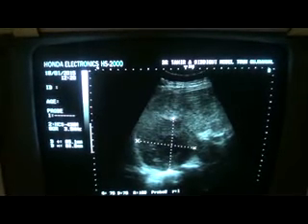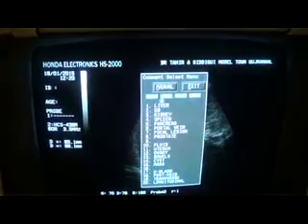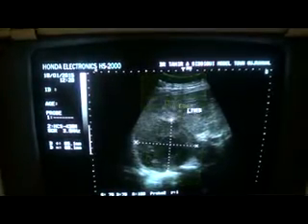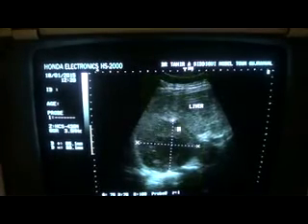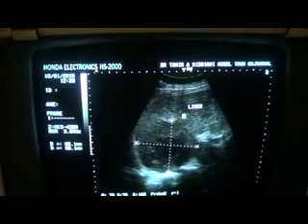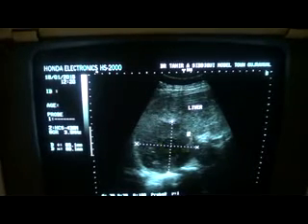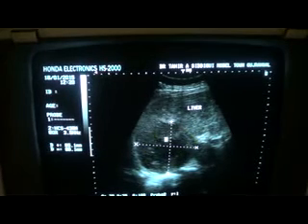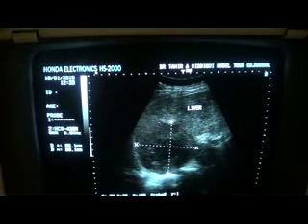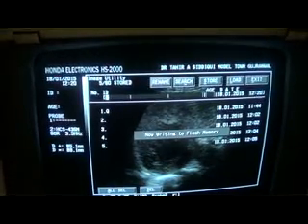Now this focal lesion, this is the liver, and you see that the echogenicity of this area is relatively less as compared to the adjacent parenchyma. I can also report that there is a cystic area surrounded by a thick rim of hypoechoic area around it, and the cystic area is full of very low level echoes.